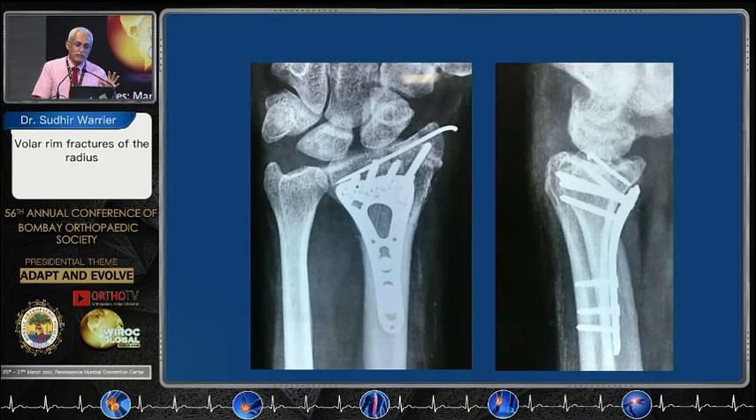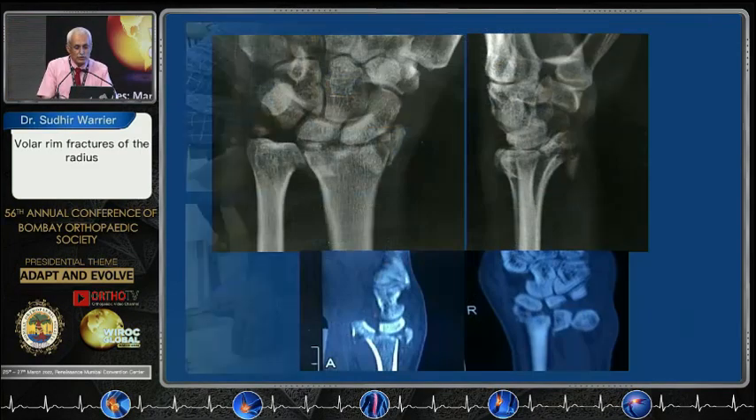Once you do that, leave that wire in. In the lateral view you can see your pin going all the way down to that teardrop, holding that teardrop as well, and the plate is buttressing what you want to buttress to get a good result.